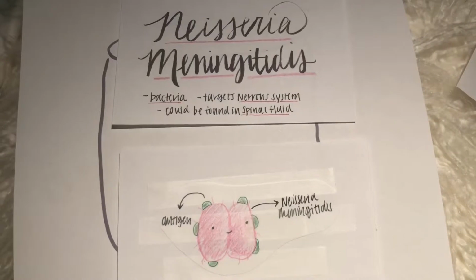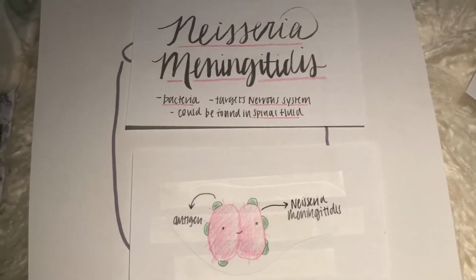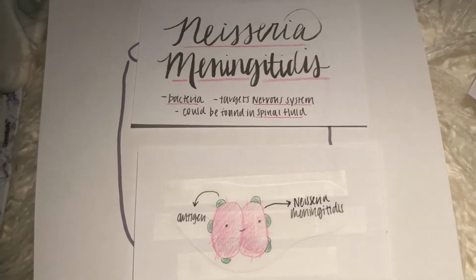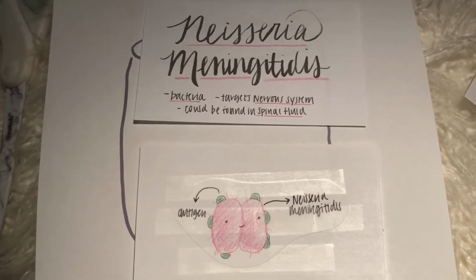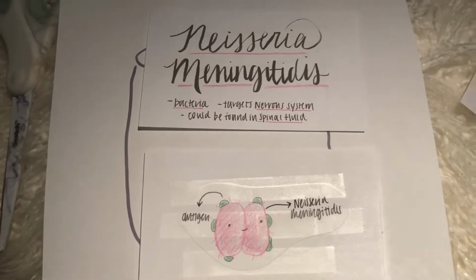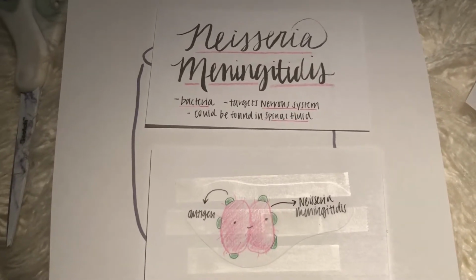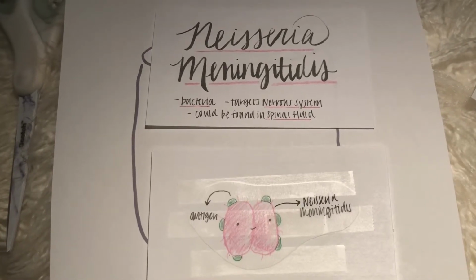When testing whether a patient has this specific antigen or the condition, we want to get a sample from them, which could be a bodily fluid. For Neisseria meningitidis specifically, we should definitely use a spinal tap in order to get cerebral spinal fluid, because the bacteria itself targets the nervous system.